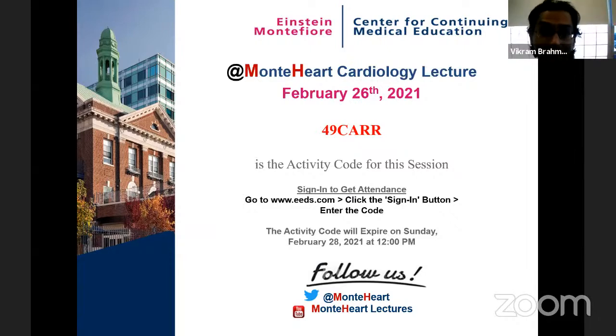I didn't touch on dobutamine stress at all, and there's excellent data for dobutamine stress MRI, and also even looking at viability over late gadolinium enhancement. We didn't do as much dobutamine stress where I was, partially because it's a little bit more resource intense in terms of having nursing and monitoring and having patients in the scanner a little bit longer. But similar to echo, it really offers a lot of good information.